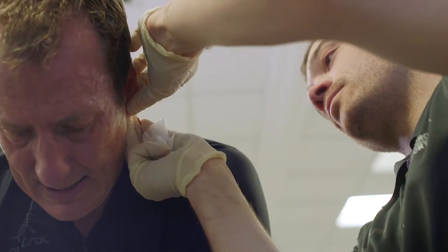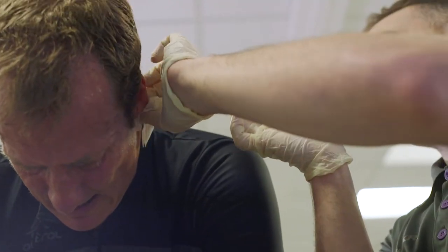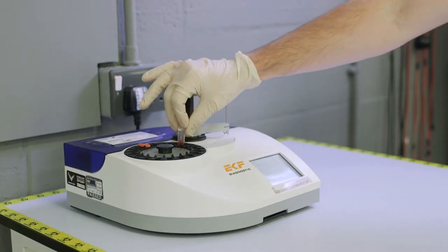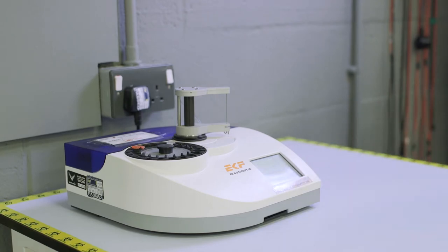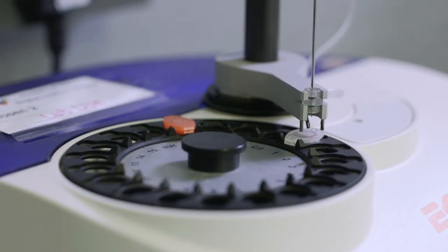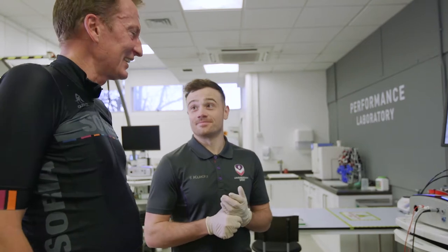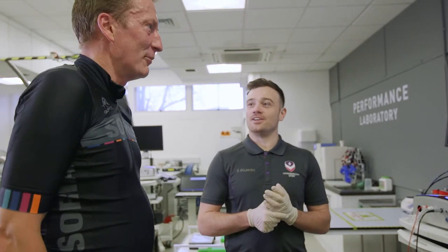At the end of the max test we'll take a blood sample from your earlobe to assess your maximal blood lactate values, to see how high you're able to push that during the test. We'll then give you 10 minutes just cycling easily on the bike, basically to get your blood lactate levels back to a normal baseline before we start the next sub-maximal test.